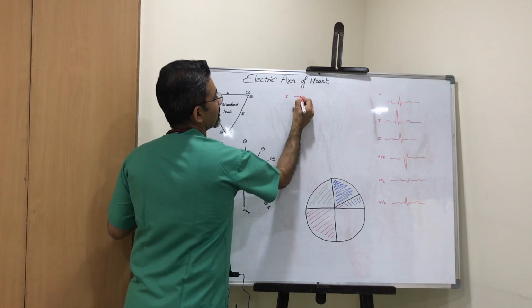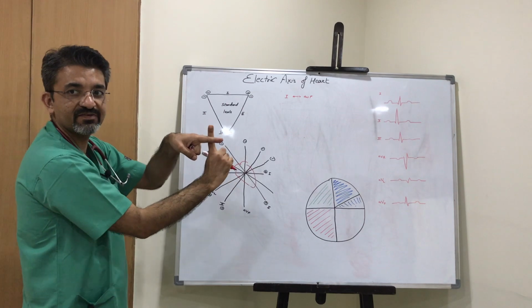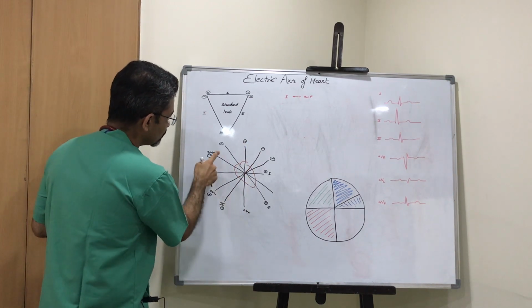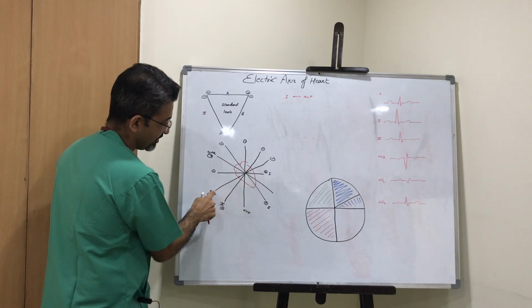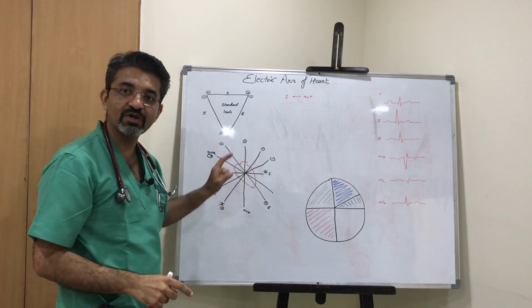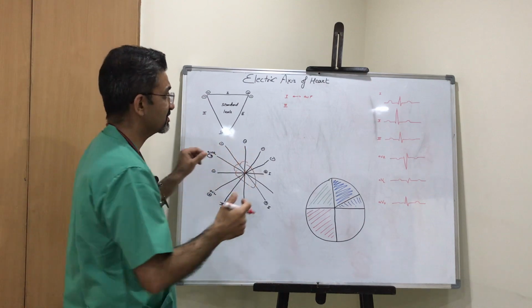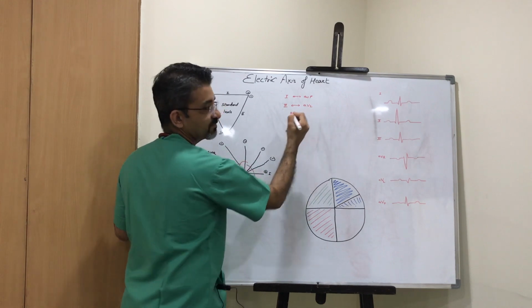So we have a pair, lead 1 and lead AVF. Lead 1 and lead AVF are perpendicular to each other. Similarly, if we have an equiphasic or a null deflection in lead 2, that means I will have maximum deflection in AVL because the current is directly perpendicular. So if I have an equiphasic or null deflection of QRS in lead 2, it means I have a very robust deflection of QRS in lead AVL.